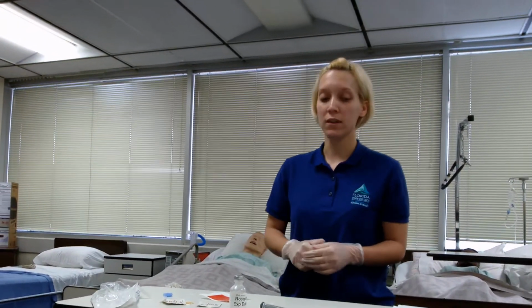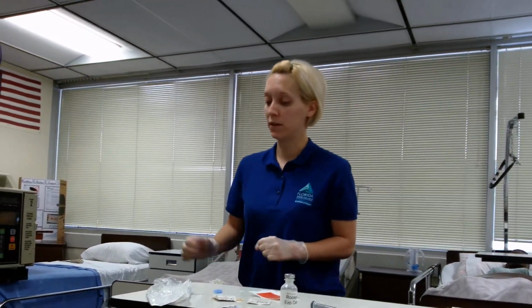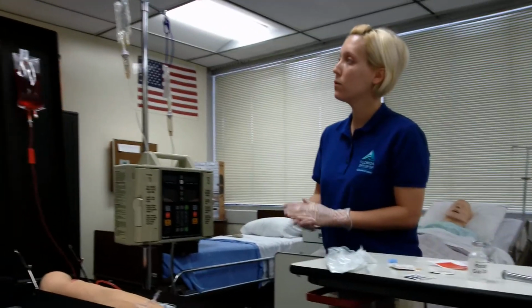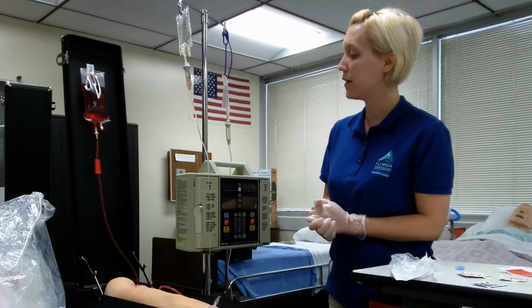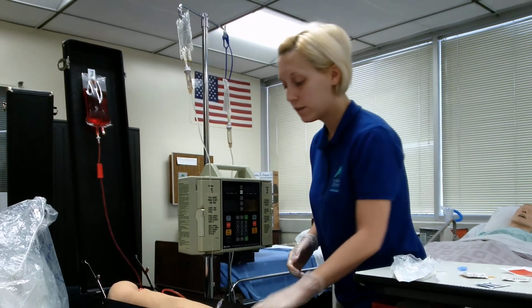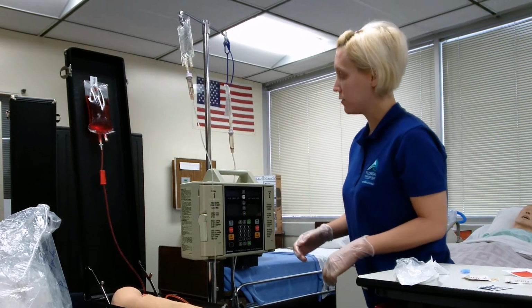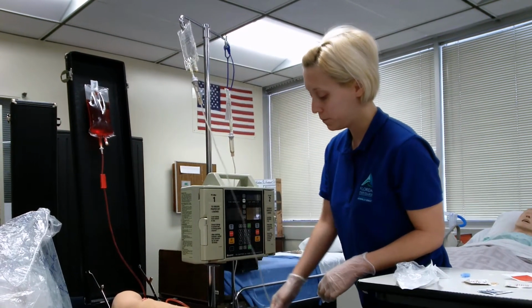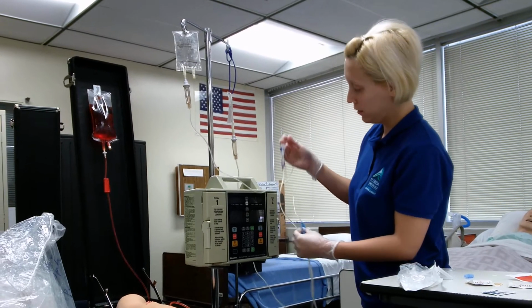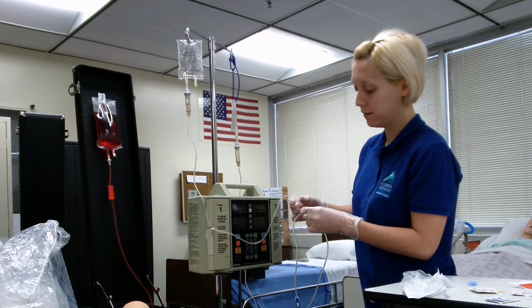So now we're going to assume that 30 minutes is up, and I'm going to make sure I check the patient's chart again. I'm going to knock. Mrs. Jones, it looks like the Rocephin, your antibiotic, is finished. So I'm just going to stop that for you. Can you confirm your name and date of birth? Okay, good. So what we're going to do now is clamp it, which would be empty.